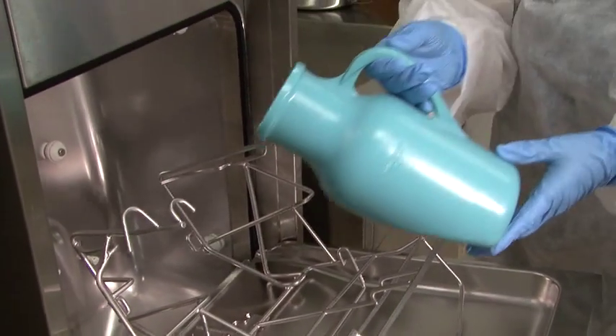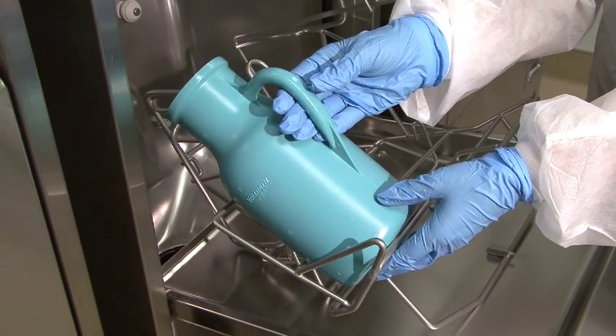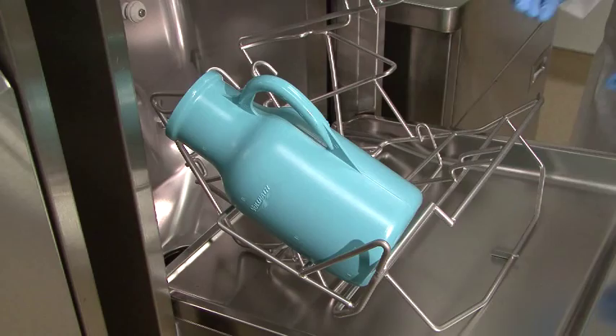It is very important to load urinals correctly with the opening facing away from you, hook inside, handle on top, seated down into the rack holder.